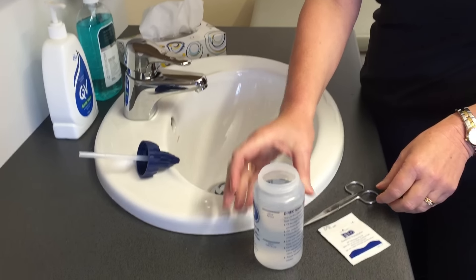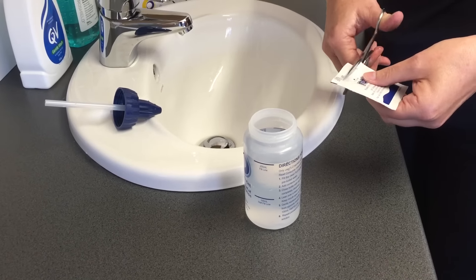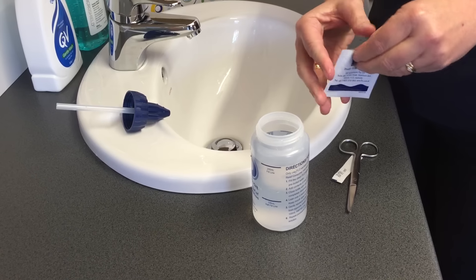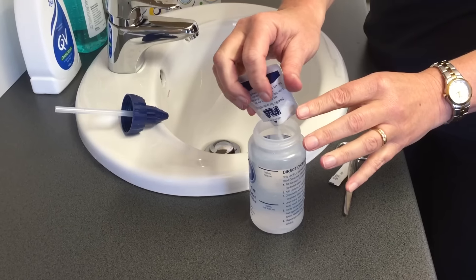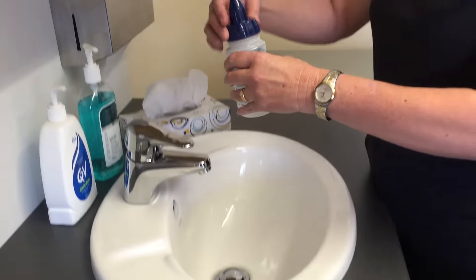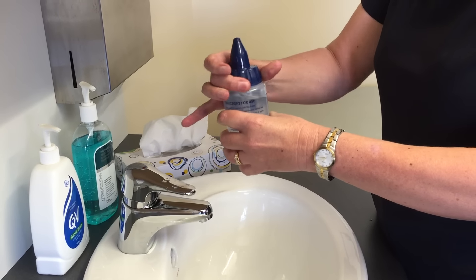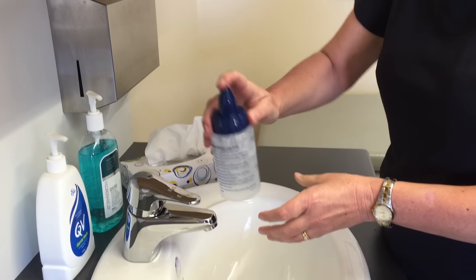Then add a sachet of salt. Replace the lid of the bottle. There's a hole in the tip of the bottle — cover that and then shake the bottle vigorously until all the salt is dissolved.